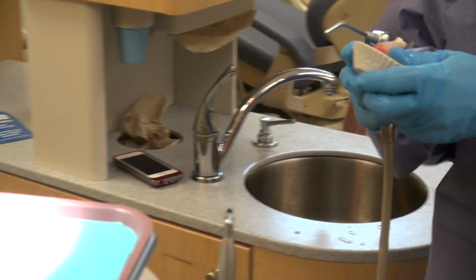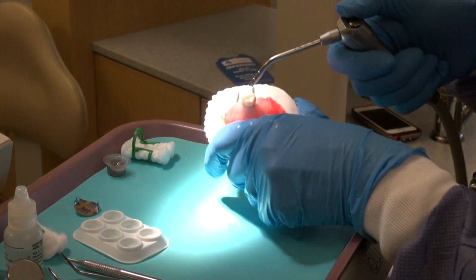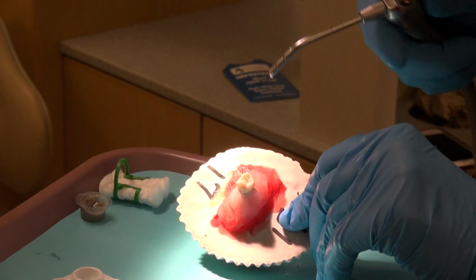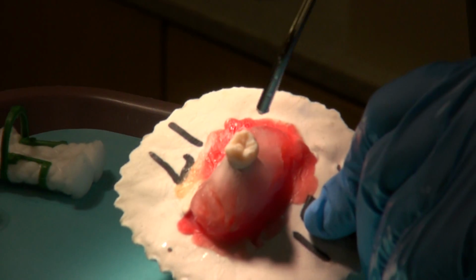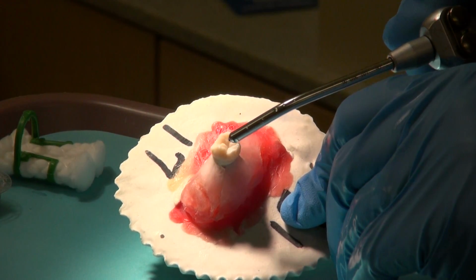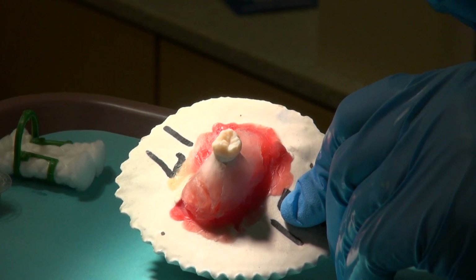We're going to come over under the light and take a look. And what we're looking for is a nice etched occlusal surface. It should be white and chalky in appearance. And you may not see intraorally up at the cusp tips white and chalky, which is fine. We don't need to see that.